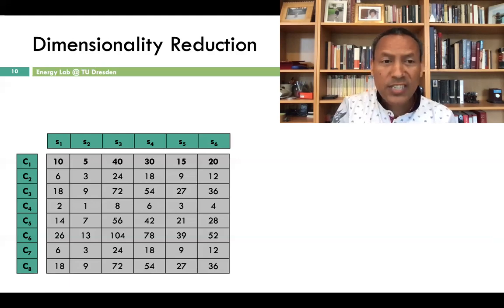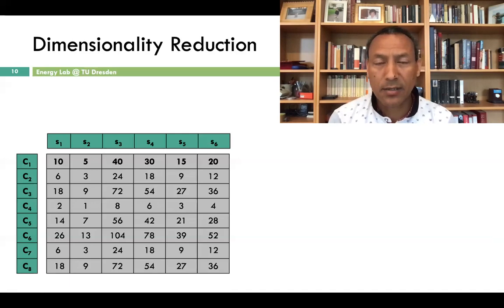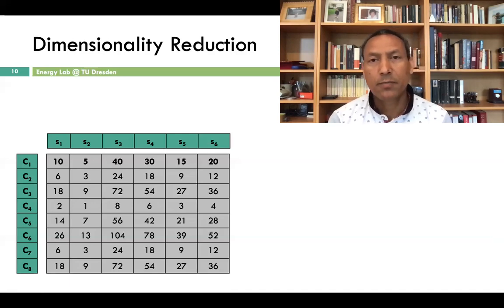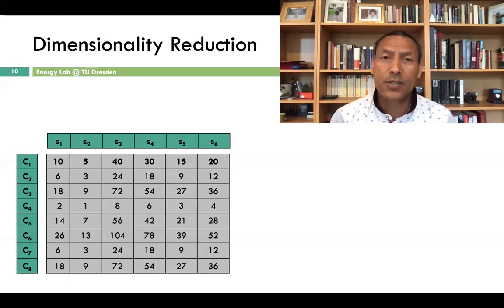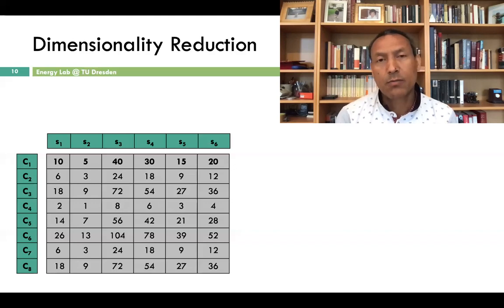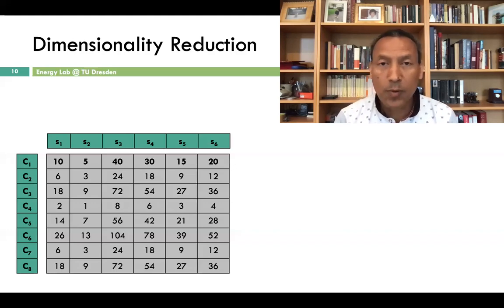Because we synchronously sample, each device emits a certain number of values at predefined time intervals. Now, because all these devices are observing one and the same patient, do they agree in their observation? Or do they deliver some complementary observations?